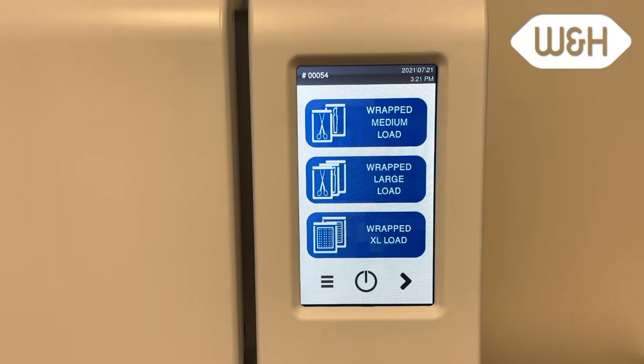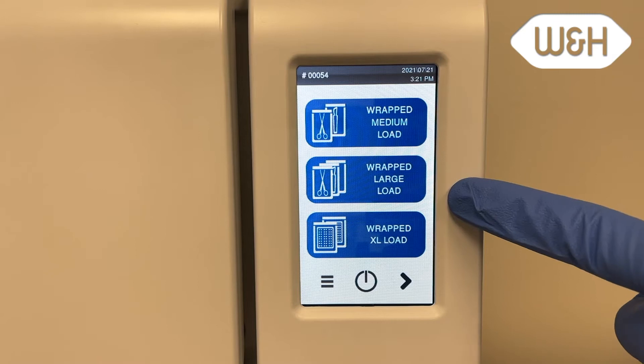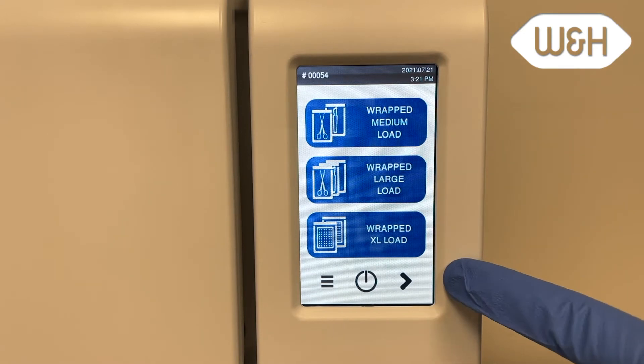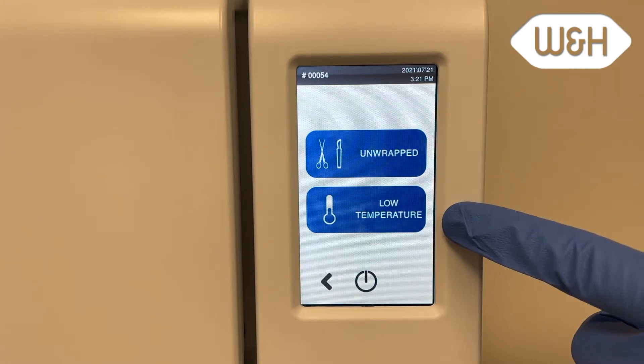The Lexa has five FDA approved cycle options for various loads. It's easy to navigate the two pages of cycle options by pressing the left or right arrows. The cycle options are wrapped medium loads, wrapped large loads, and extra large loads. There is also an unwrapped and low temperature load selection.